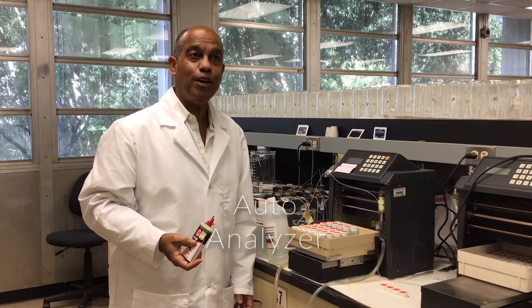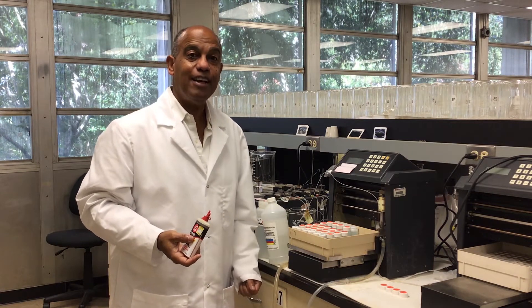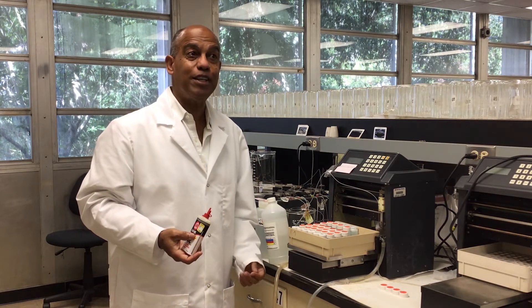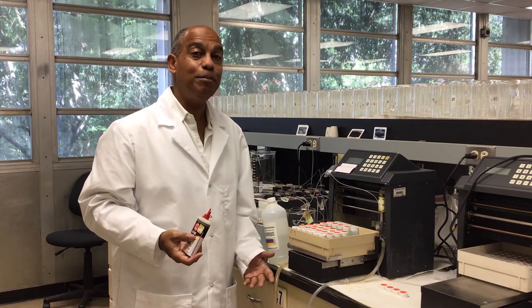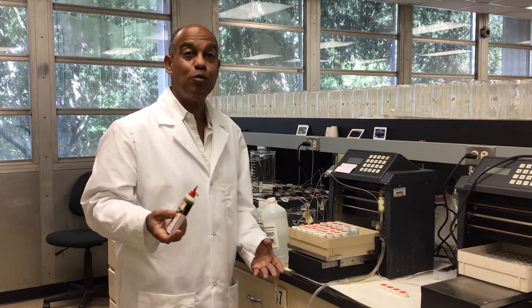Our auto analyzer is what we use for nitrogen and phosphorus determination, and it's really important to keep it working. There are a lot of moving parts in it, so part of the maintenance is to keep those moving parts working.